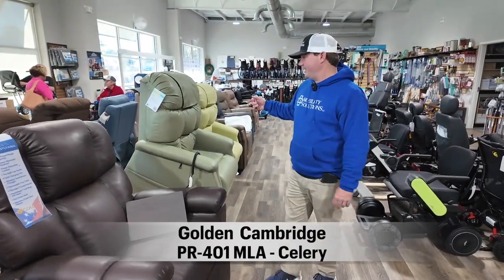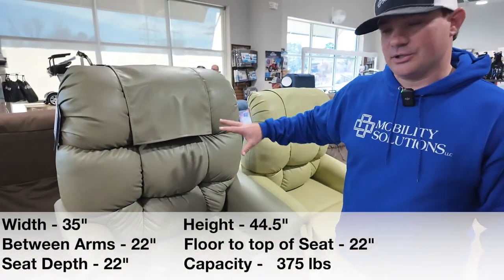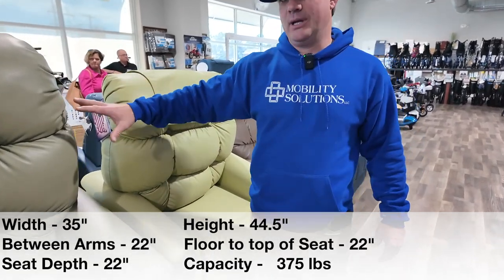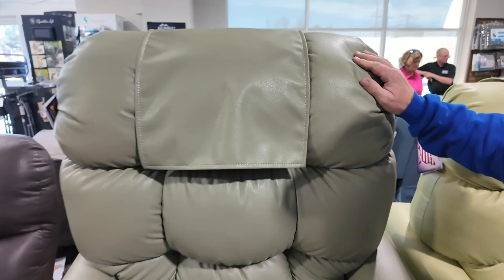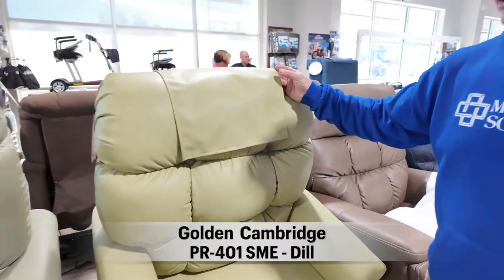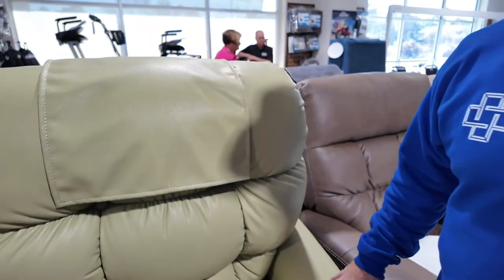Right beside it is a Cambridge. This is your standard Cambridge MLA. It comes in two sizes — this is the Cambridge SME — and these are two new Brisa color fabrics. This is Celery, which is like a darker green, and this is Dill, which is like a light green. It's more of a beachy theme, which I like about it.